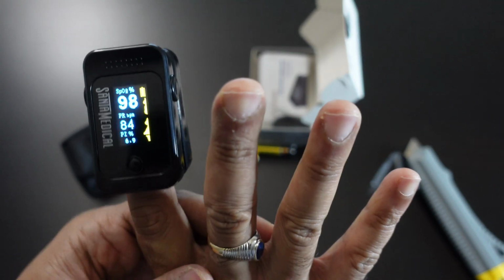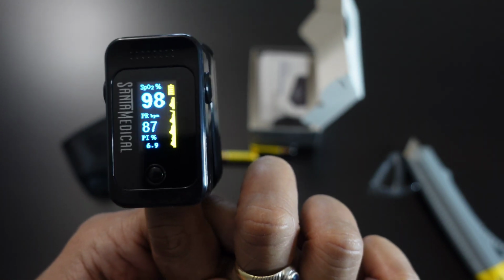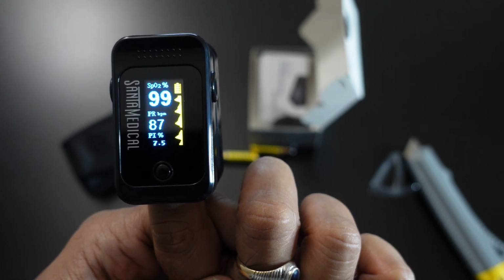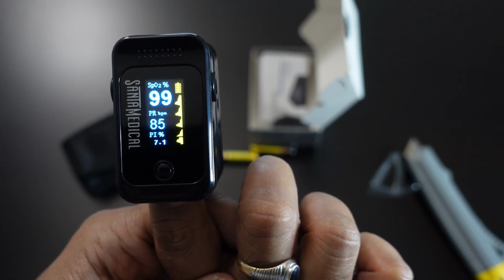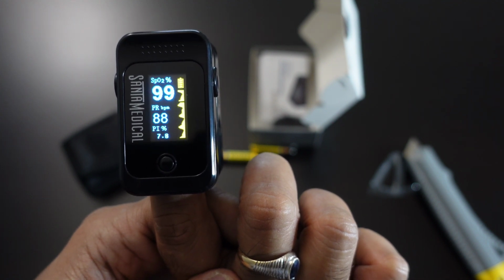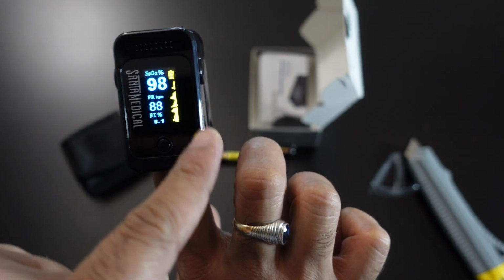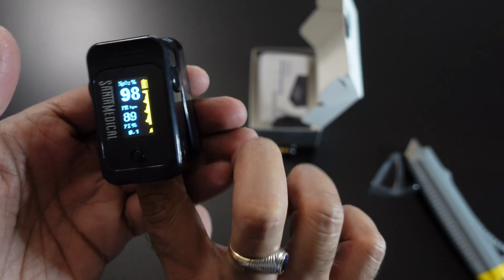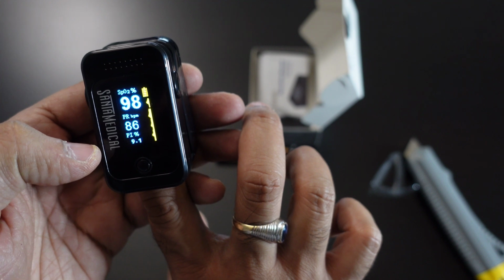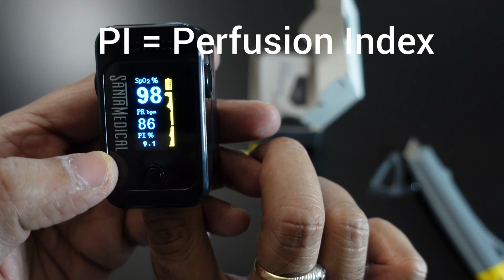So as you can tell, the oxygen levels are 98, right? With the pulse reading BPM or beats per minute is 87, and it is doing that in real time, 87, 88, 85. It's fluctuating between that, which is an excellent thing. And it gives a side reading of that sort. Maybe that's the graph for the pulse or the way your heart beats. The PI percentage, 9.1, I don't know what that stands for and what is that used for.